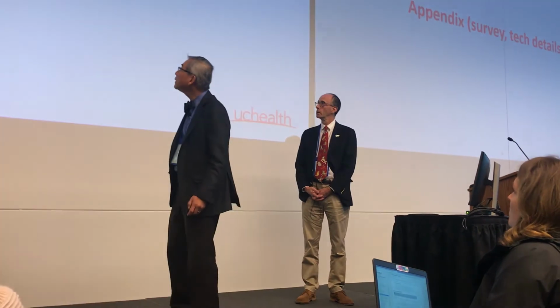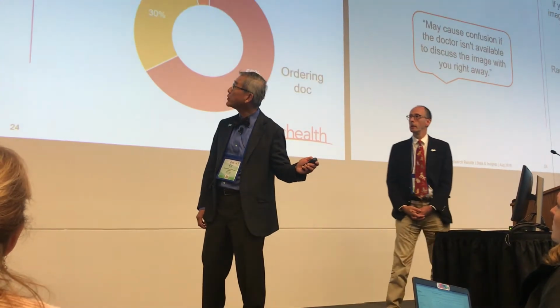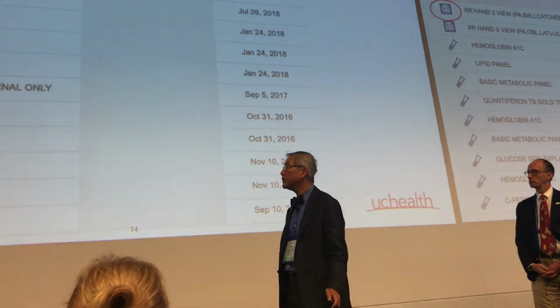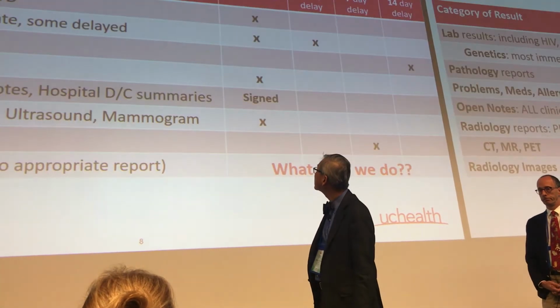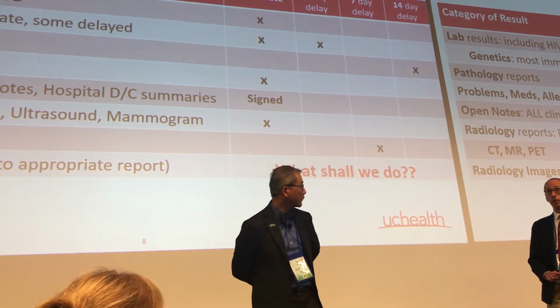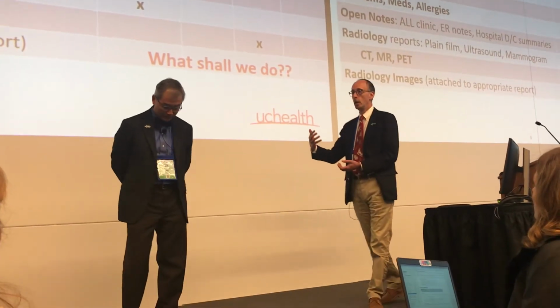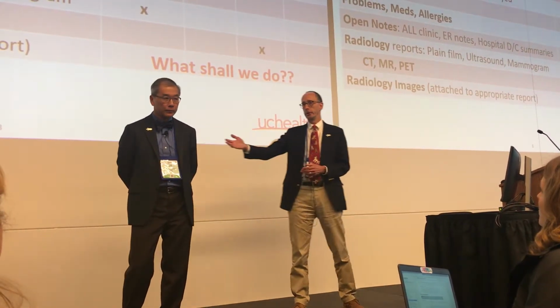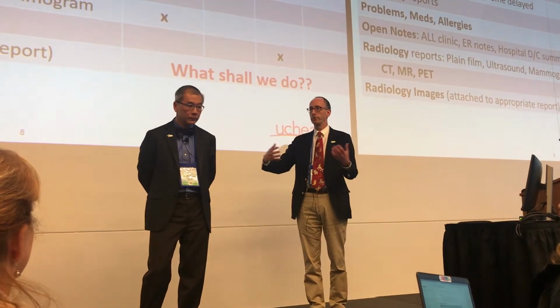Yeah, let me go back. Yes, we do have a set of rules. Our radiology rules are basically that plain films go immediately. Complex imaging, CT, MR, and PET are 7 days. Right, so plain film, almost all ultrasound and mammo go immediately, and the others go at 7 days, although CT and I are engaged in pushing the rock up the mountain to try to shorten that. CT is a pioneer in open notes, and so we have the same philosophy, he and I, about results release.